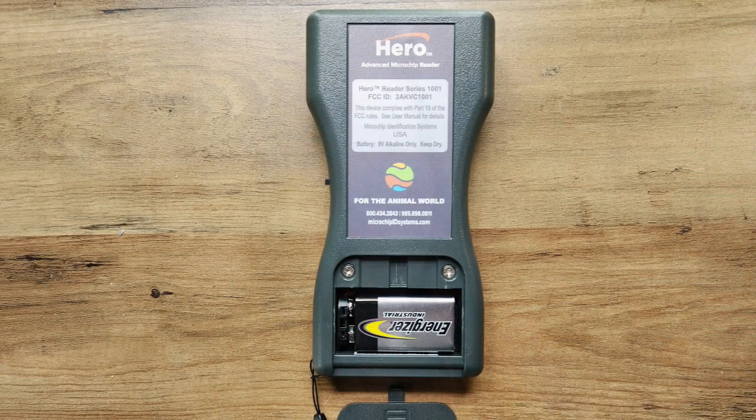Some industrial-strength scanners, like the Hero I mentioned, use regular non-rechargeable batteries — that's why it has an on/off switch, to conserve battery life. With those, make sure you have fresh batteries. If it's been sitting for a while, check or replace the batteries so they don't corrode or lose power, and make sure the scanner is fully functioning before you use it.